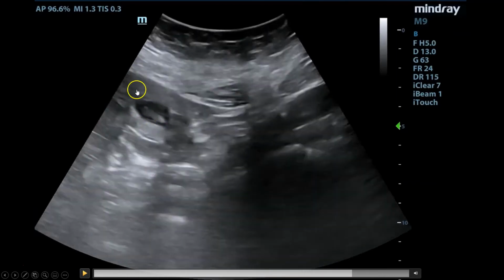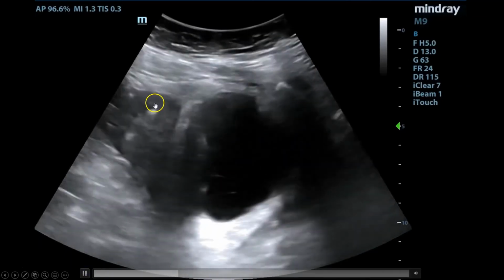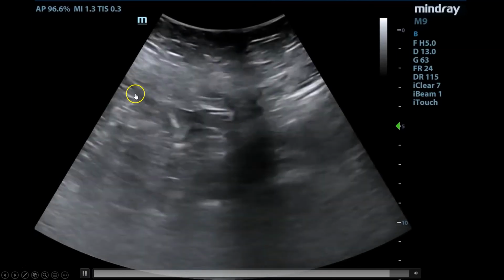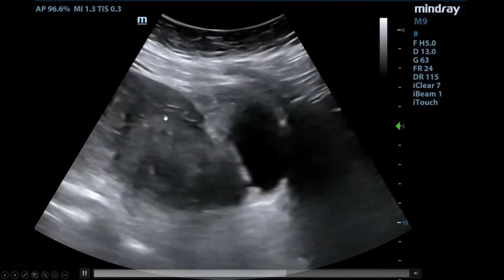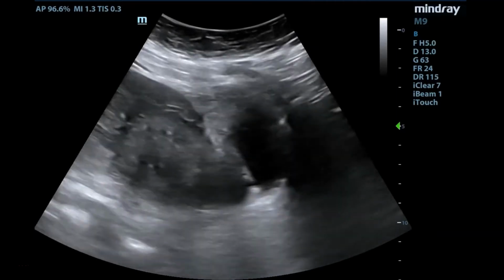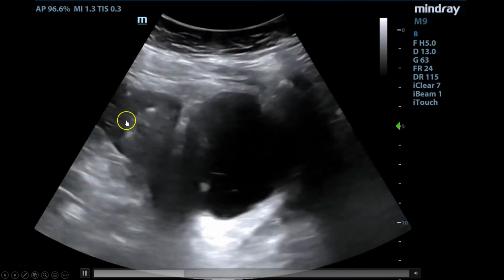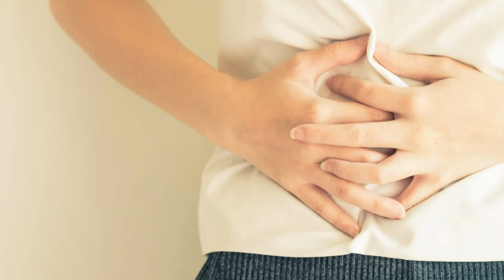And so this is the pregnancy, and we've seen that the uterus has already come and gone. So we'll do it one more time. Here's the uterus, and a sort of weird echo texture thing, and then there's the pregnancy. So this ended up being an adnexal pregnancy that was actually live, and you could track it and see that the fetus was living, but it was causing substantial hemorrhage around it, and that was the odd-looking echo texture above it. All right, moving on to the next time we want to do this.